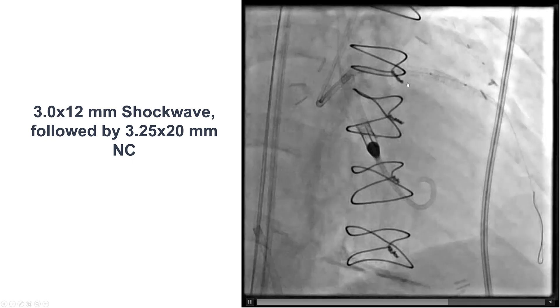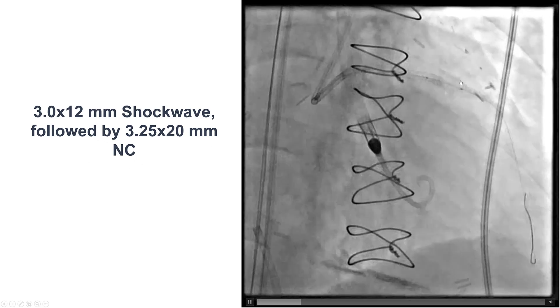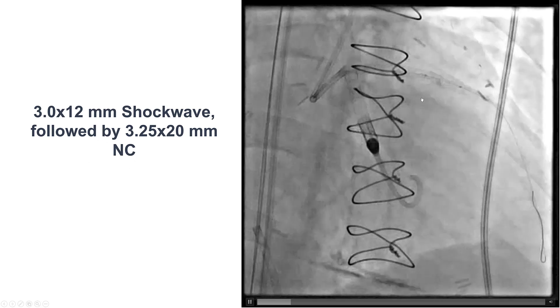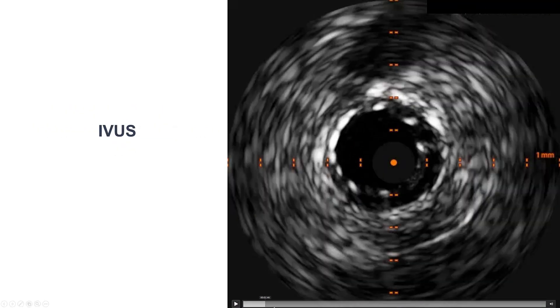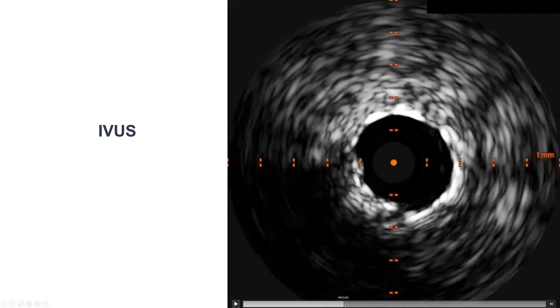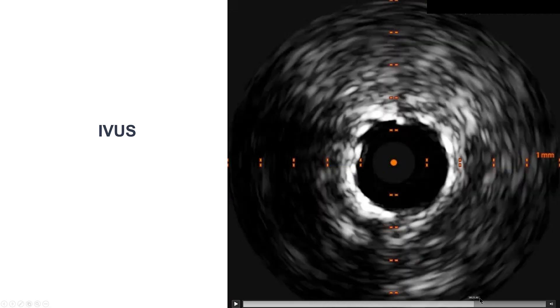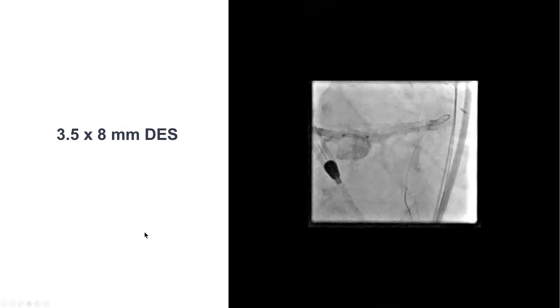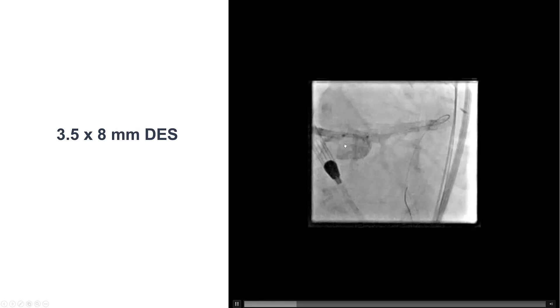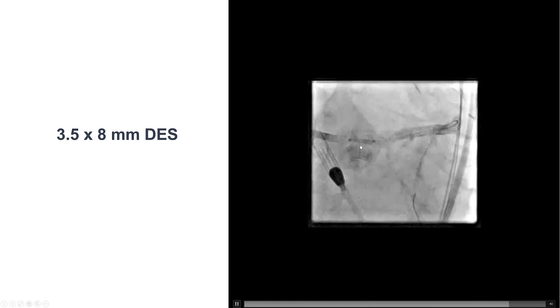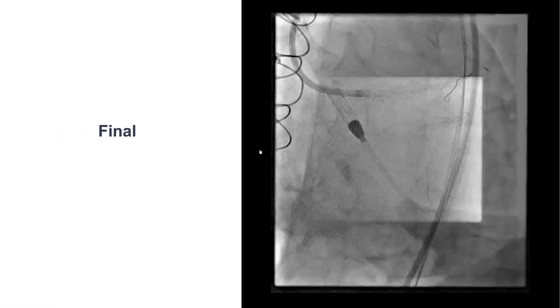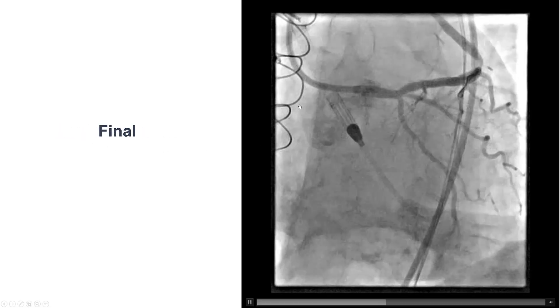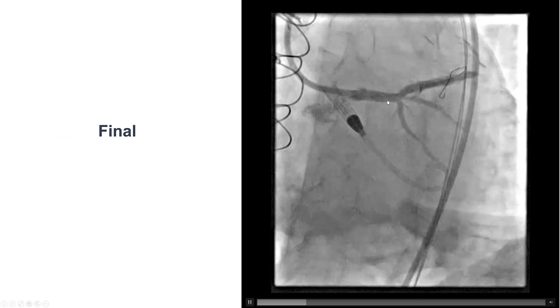So we ended up repeating intravascular lithotripsy, this time with a 3.0 mm balloon, and we were then able to expand it with a non-compliant balloon. Here is the final intravascular ultrasound — we can see that there is good expansion throughout the stent into the LAD going all the way to the left main. The left main was not completely covered by IVUS, and that is why we placed an additional 3.5 by 8 mm drug-eluting stent.